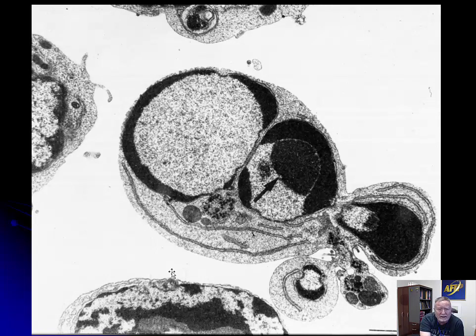In the case of human Burkitt's lymphoma, once again, we have neoplastic B cells with a high rate of turnover. Here we have one that the nucleus probably looks pretty good, or over here. Then we have one that's undergoing apoptosis. You can see the formation of the crescents. The nucleus is breaking up into fragments. Little blebs are blebbing off of the cell, but the organelles look great.